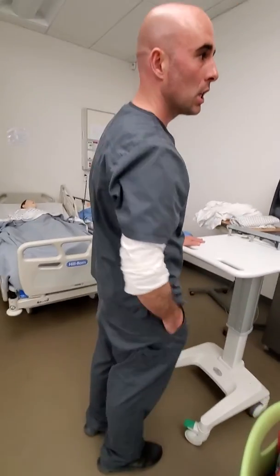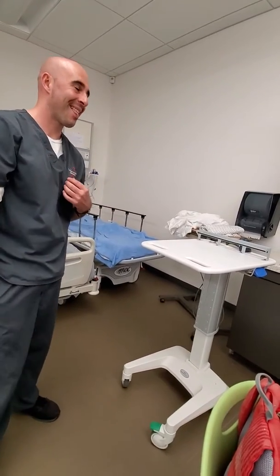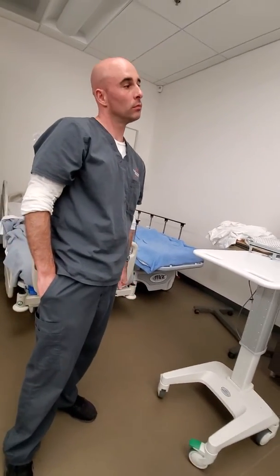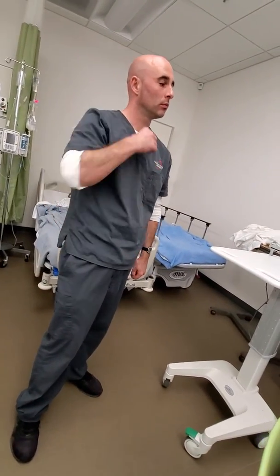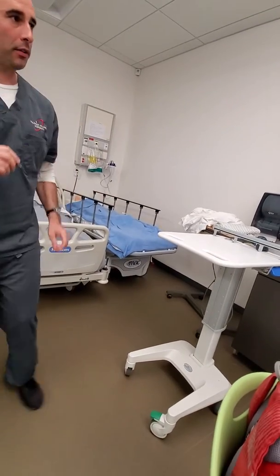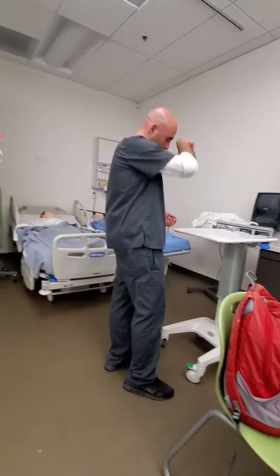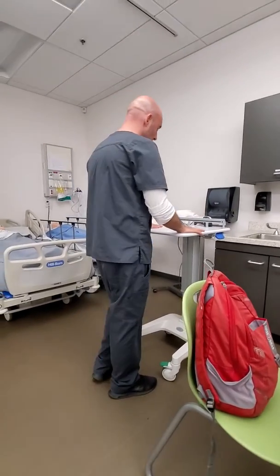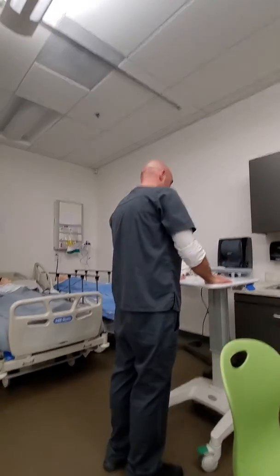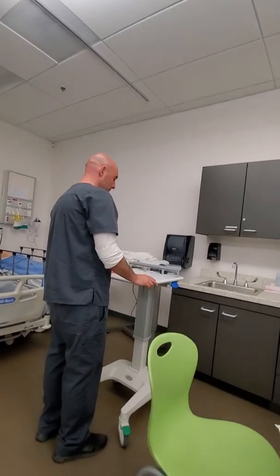Okay, so you'll come in, you'll pick your scale, say it's this one, and we'll tell you that you're going to be administering Ansef, 1 gram in 100 milliliters to infuse over 45 minutes. Can I get a piece of paper and do the math so I can get the hang of that? That's fine. I have my computer and I'll look on the computer to see what the doctor wants me to hang. So take it off, but don't crumple it. Ansef. Keep it off.